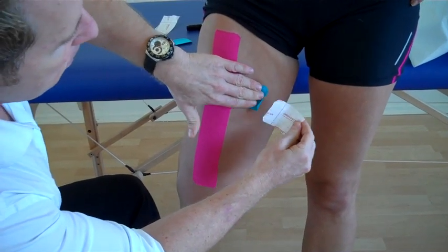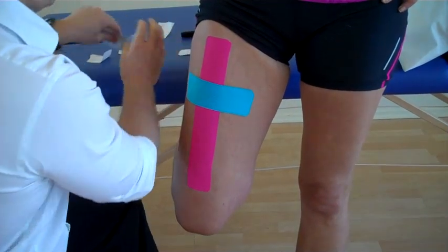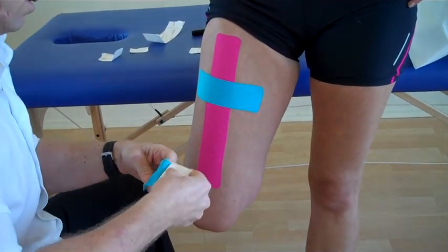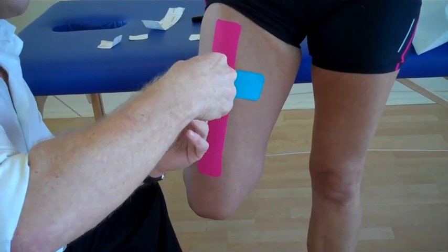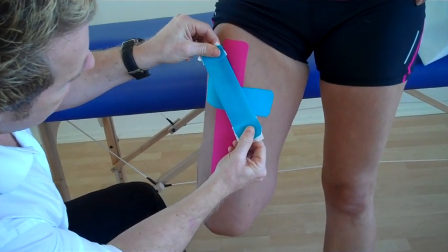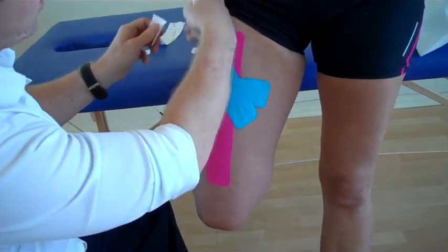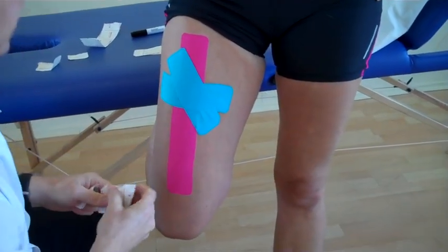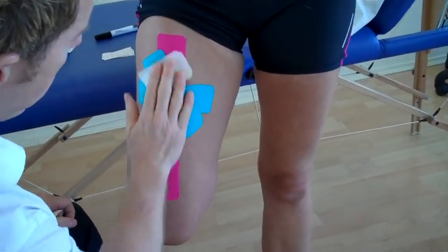Maximum stretch and apply over that area, then literally feed out that last bit of tape. Same with this one — just literally feed out that tape. So peel back, peel back, fold over. Think about the shape here — maximum stretch and come across, the last bit feed out, and the last bit feed out. So we've done an X-shape over the area.